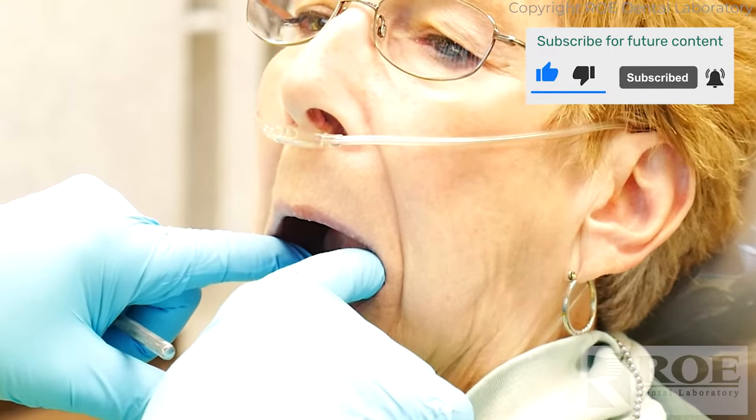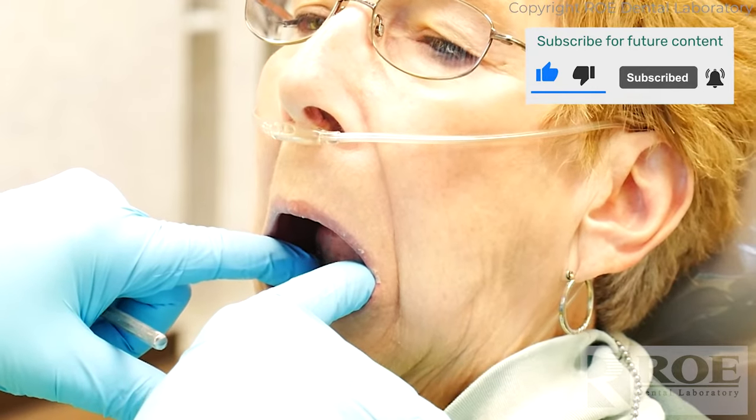Is that giving you support? Is that okay? Yes, sir. It's being a little stiff, but I want to give you some support if that's okay. A little suction there — you can close a little bit if you want. A little bit of suction there.